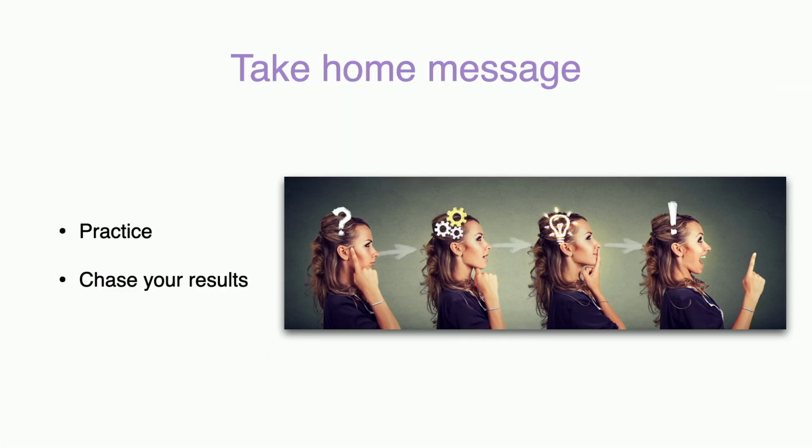In order to improve your ultrasound skills in gynecological ultrasound, it's necessary that you chase the results after, for example, surgery and compare your findings with histology. Let me give you a few final tips. Keep practicing and chase your results. Compare your findings on ultrasound with other imaging modalities and/or to histology. And that way you will improve your gynecological ultrasound skills.